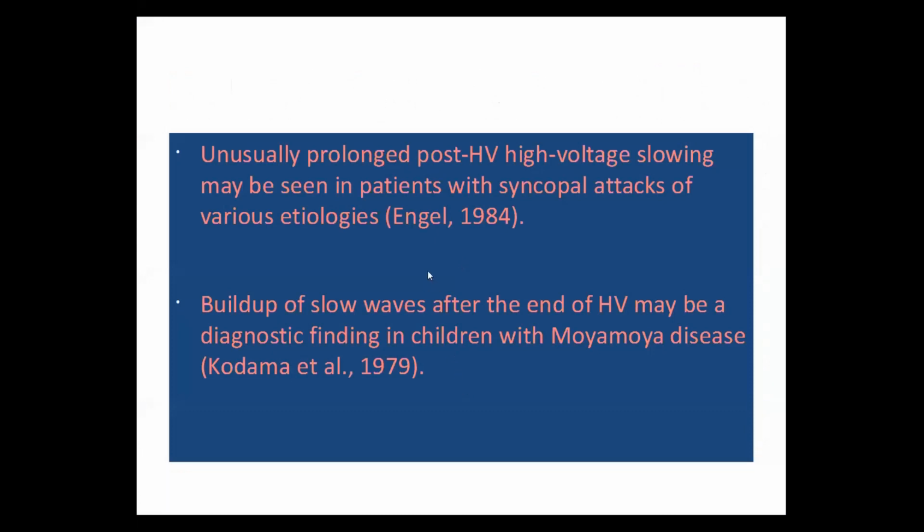Now the other thing which I mentioned earlier was an unusually prolonged post HV slowing, high voltage slowing. This buildup of slow waves after the end of HV may be a diagnostic finding in children with moyamoya disease. That's the reason why you should continue the post HV recording for at least 3 minutes.